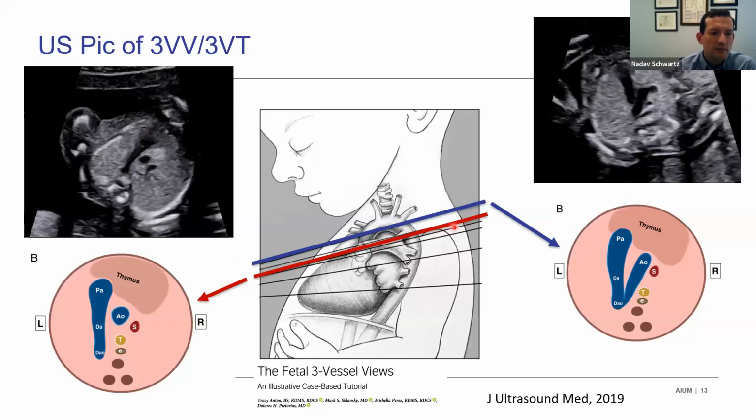And looking here, this is just a parallel view above the four-chamber view, going through the mediastinum in almost the same axis as when you're getting the four-chamber view. Just move cephalad, up towards the head. And if you keep going a little bit higher up in the chest, with a little bit of a twist towards the shoulder, you can get this three-vessel trachea view.